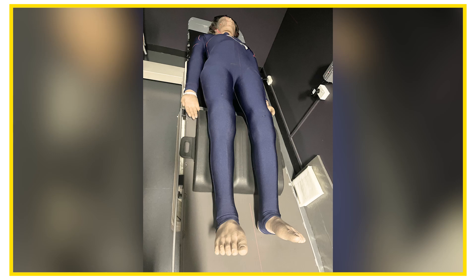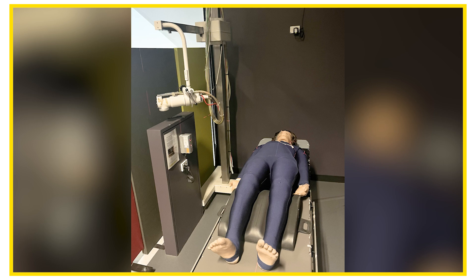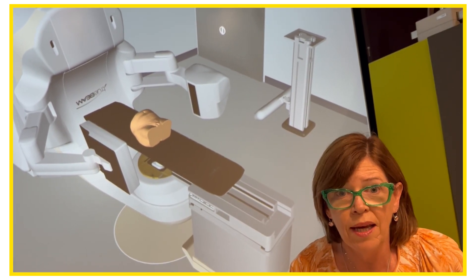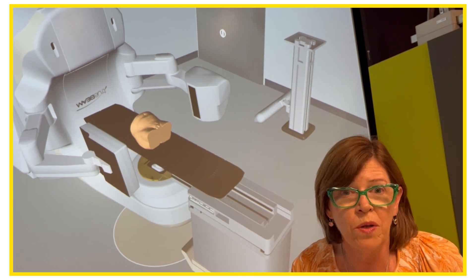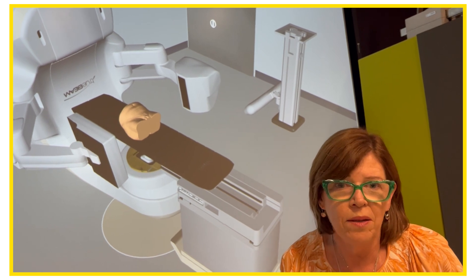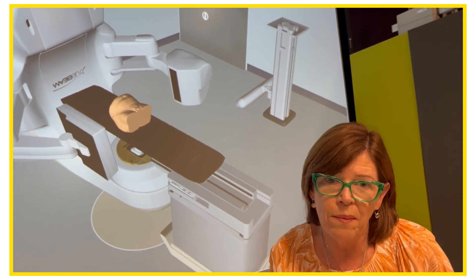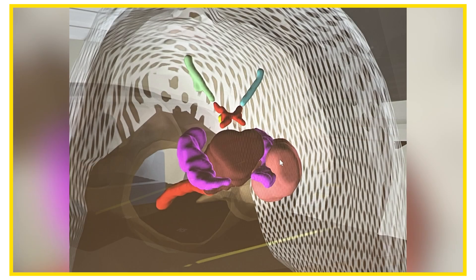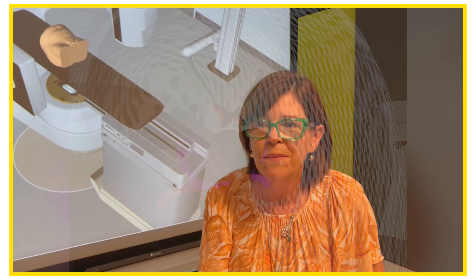Undergraduate radiation therapy students do a lot of their preparation for clinical placement right here. We're able to do most things you'd expect a clinical machine to do, except expose with radiation — it's all virtual. We can mechanically simulate all the parameters of a treatment, put a virtual patient on the couch, and even make the skin transparent to see the organs.